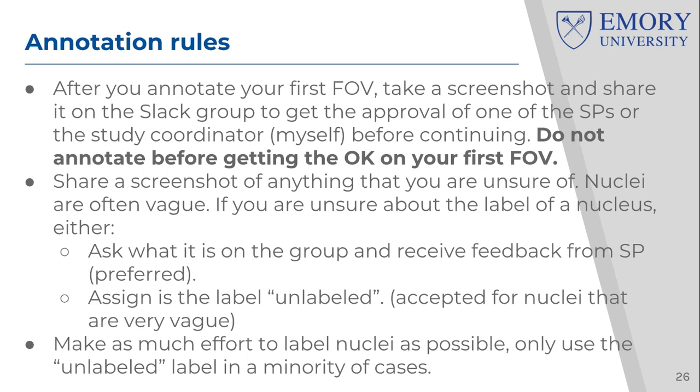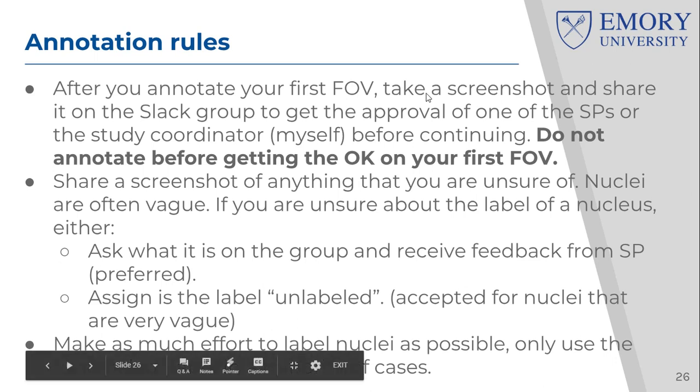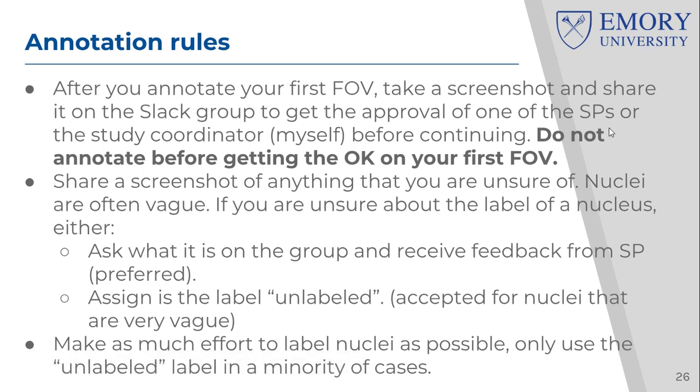After you annotate your first field of view, don't keep on going and annotate new ones. Take a screenshot, share it on the Slack group, and wait for the approval and comment by one of the senior pathologists or the study coordinator, myself. Okay? Do not annotate anything other than that. So after you finish your first field of view, don't annotate anything until you get our OK.